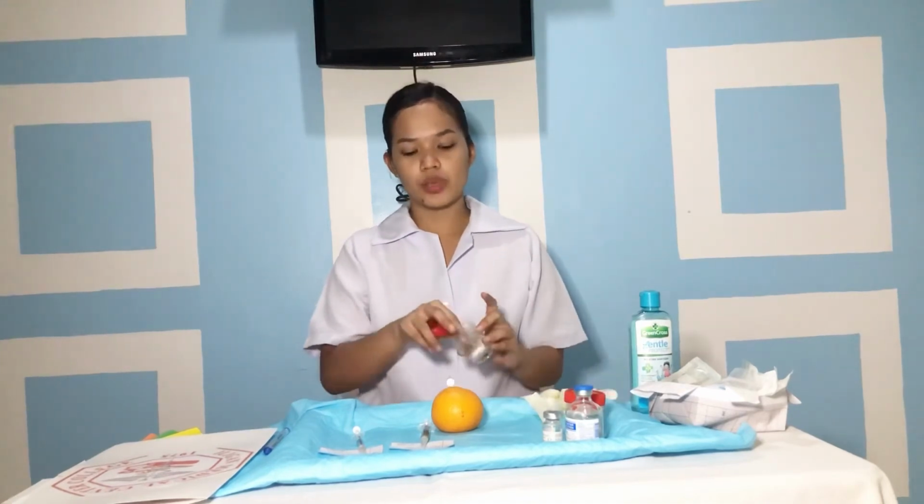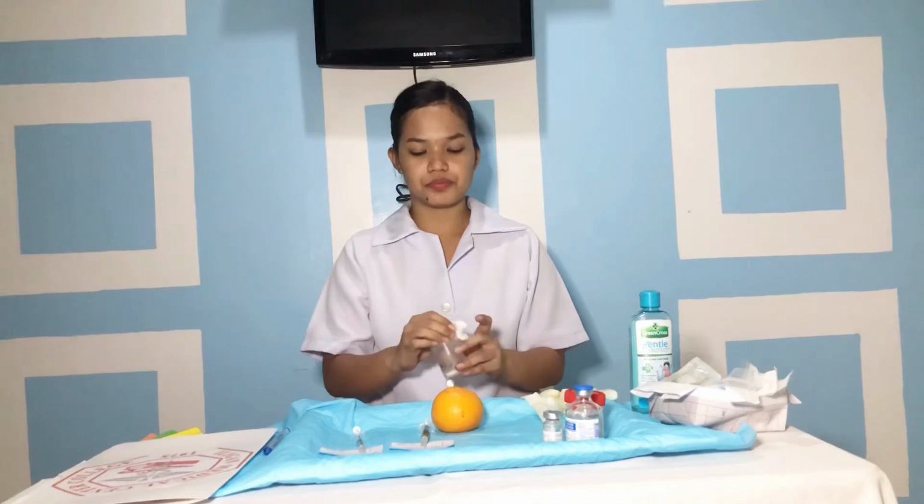Then we clean the site with an antiseptic swab. We apply the cotton swab at the center of the site and rotate outward in a circular direction for approximately 5 centimeters to 2 inches.